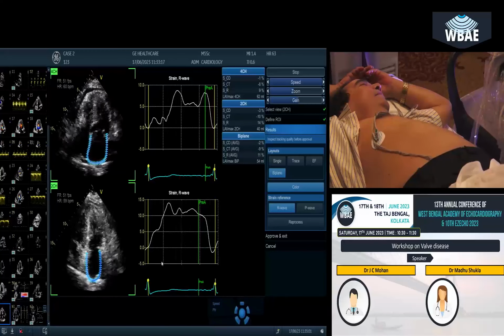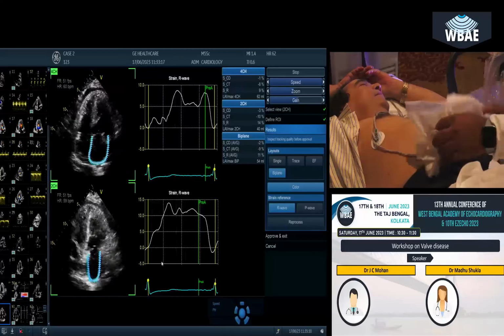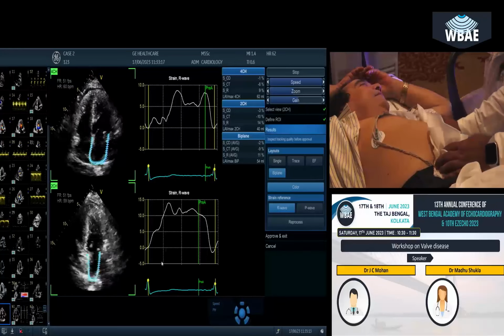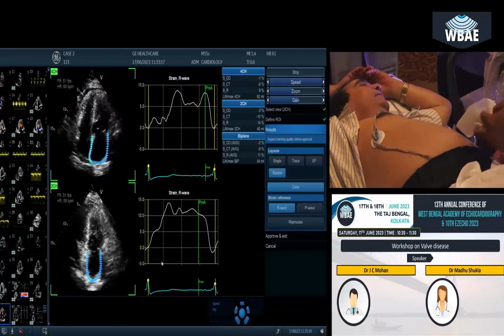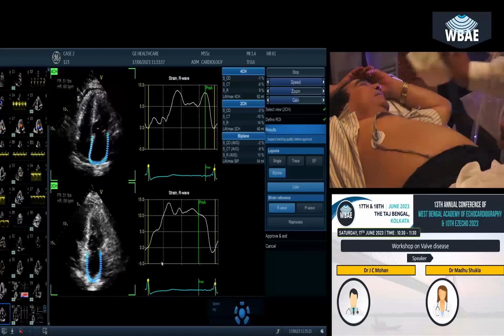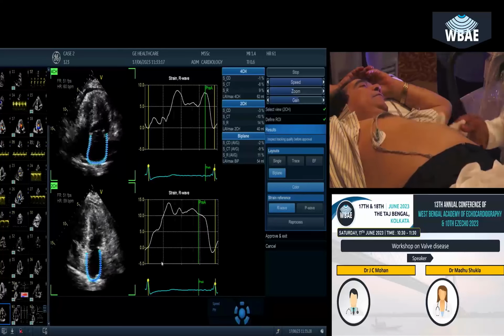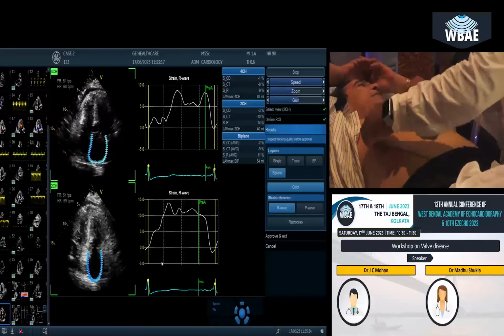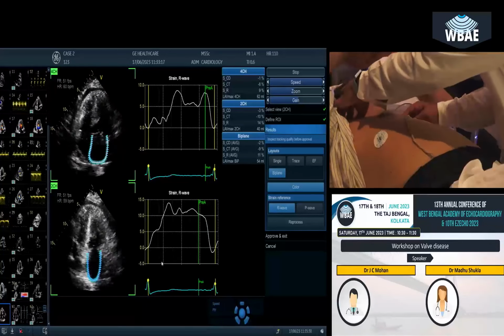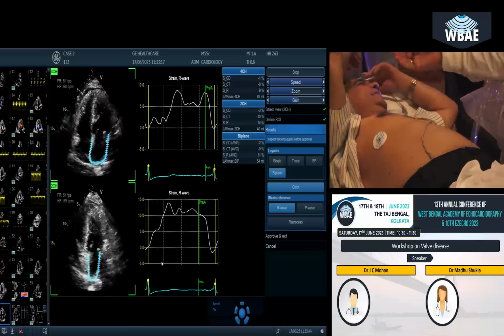Any questions so far? Yes, sir. So we no longer do M-mode actually. That is not recommended. But if you see the big turbulence in the parasternal view with color, or if you go to the four chamber, that can also be appreciated. So we're not taking it now. You can just use the typical classic 2D. I'll tell you, I do M-mode for two purposes: IVC and TAPSE.